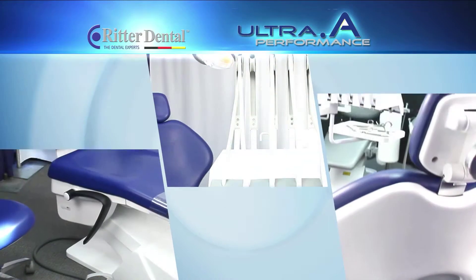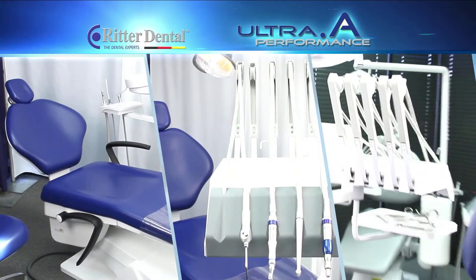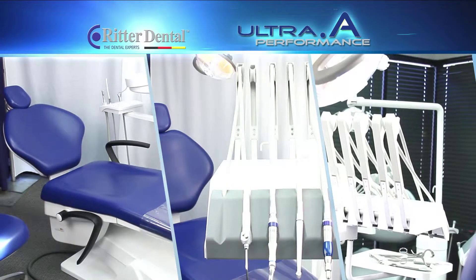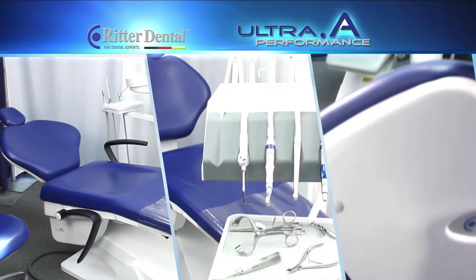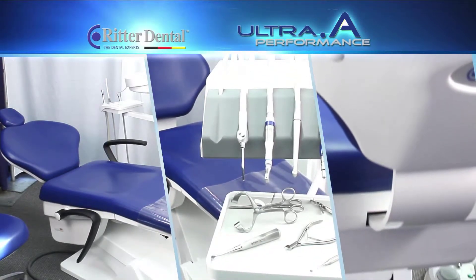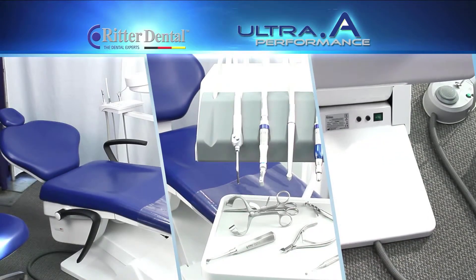The Ritter Ultra Performance A comes standard with an upgraded doctor's stool and assistant stool. The doctor's stool has either a fixed position or a dynamic movement backrest. The doctor and assistant stools are manufactured for quiet and smooth operation, featuring chrome legs and five dual casters for safety.